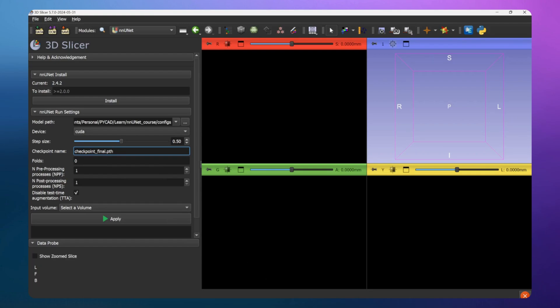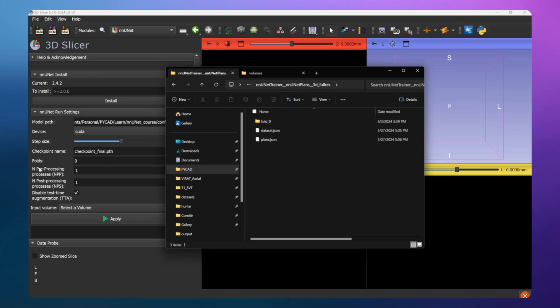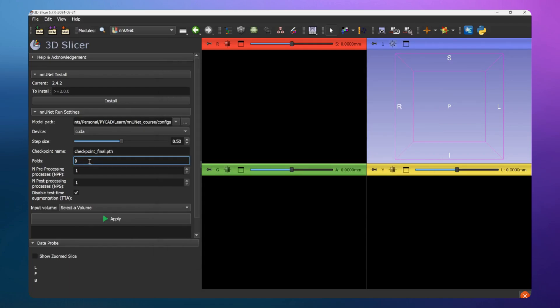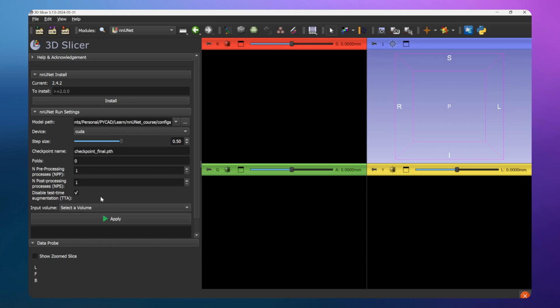Then select the fold number. If you put fold_0 in your folder, select 0 here, and so on. Apart from that, the other settings like CUDA vs CPU I didn't change. If you don't have CUDA, use CPU. The step size I also left as default, but you can experiment with these settings and leave in the comments if you find anything interesting.